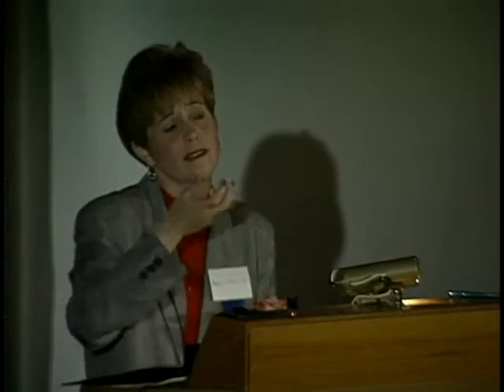Even for a 3-year-old to hold the valve and at least know that they can touch it and feel it and that it's going to be part of them really helps them adapt to it. You want to educate the child and family about the Passy-Muir valve, and we've talked a lot about education today. Education varies for various age groups, but the parents can be very instrumental.